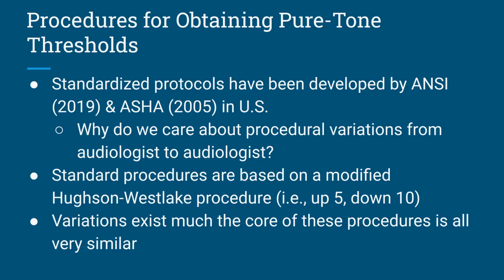So procedures for obtaining pure tone thresholds here. We have standardized protocols that have been developed by ANSI and ASHA in the US. The ANSI protocol is newer, from 2019. The ASHA protocol is from 2005. You'll probably find the ASHA protocol is more popular.